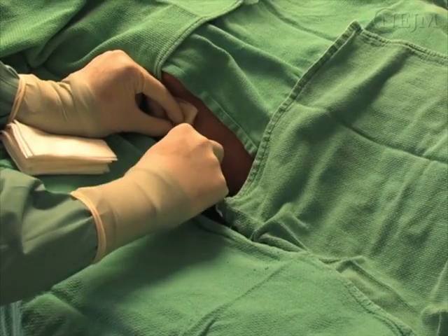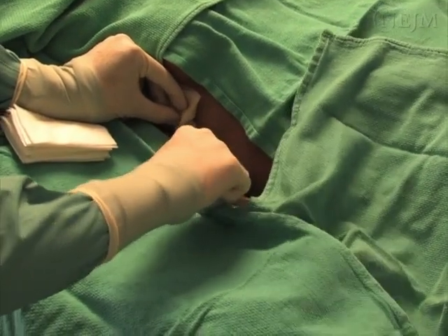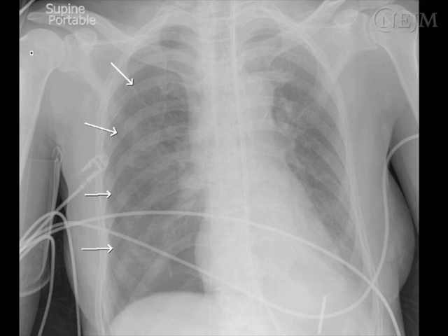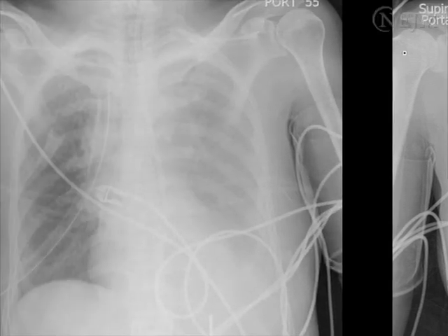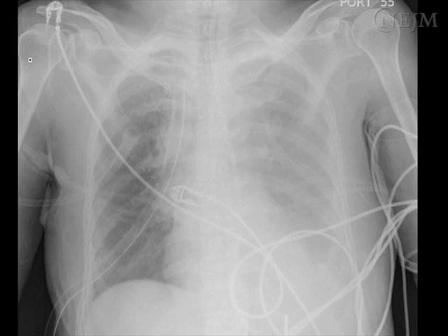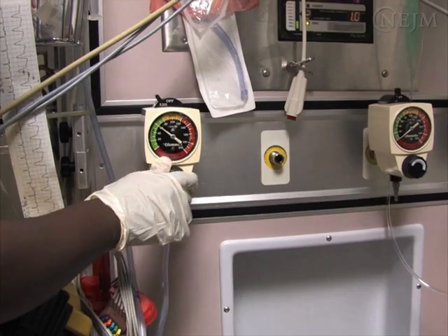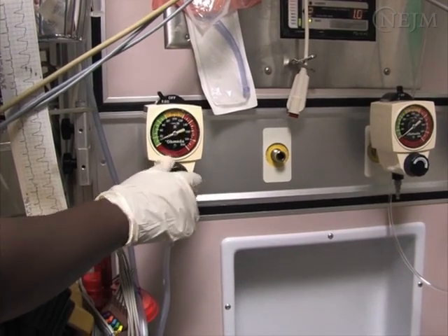The timing of chest tube removal depends on the indications for the chest tube. In the case of a pneumothorax, bubbling must have ceased, the patient stabilized clinically, and the lung re-expanded on a chest X-ray as minimal criteria to remove the tube. If suction is being applied to evacuate the pneumothorax, most clinicians perform a trial of underwater seal alone in order to ensure there is no further bubbling with the suction turned off.